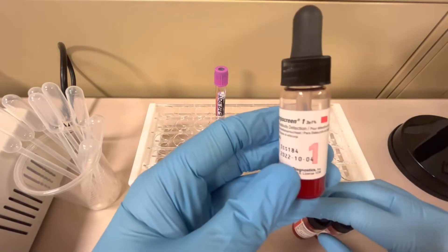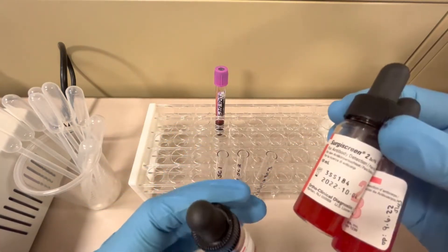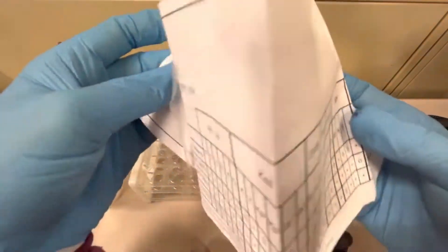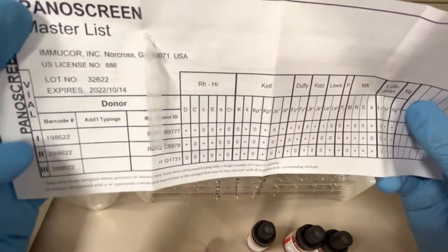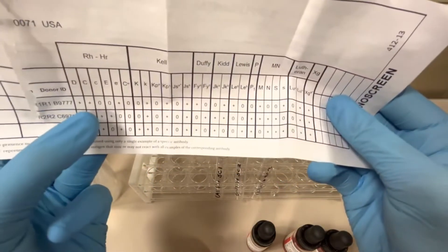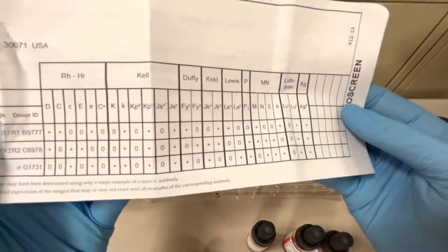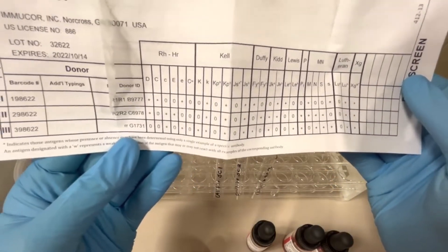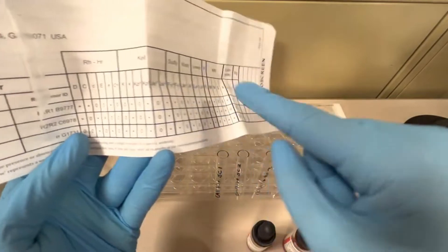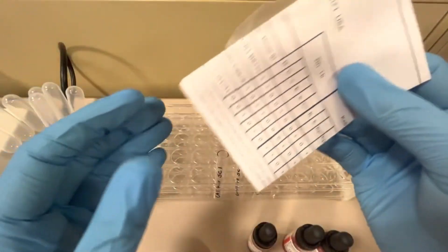The first part requires your screening cells — screening cell one, two, and three. These are red blood cells with known red blood cell antigens on them. Each lot comes with a panel showing which antigens each screening cell is positive or negative for. There are enough antigens across these three cells that if a patient has a clinically significant antibody, it will show up. Make sure you match the lot number on the panel to the lot number on the screening cells.